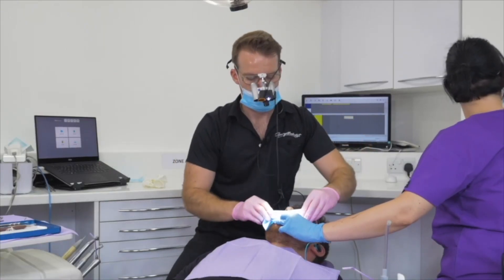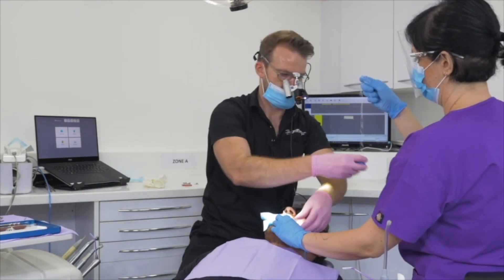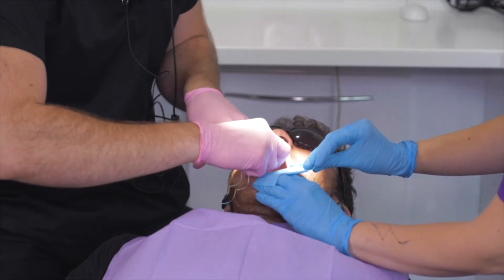This is the W8A which I use for the majority of my molar work. For my anterior work, I use the Brinker clamps quite a lot — they're really useful.